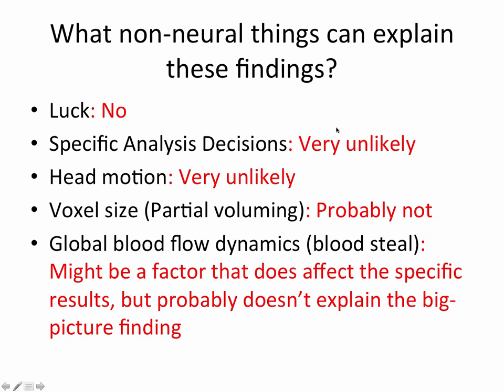So to summarize this case study, was this just a lucky finding? I don't think so. We've repeated this now in 8 subjects, 9 hours of data in 8 subjects. Is it specific analysis decisions? I think very unlikely, because like I said, we tried a lot. Is it head motion? Very unlikely. Voxel size, partial volume?